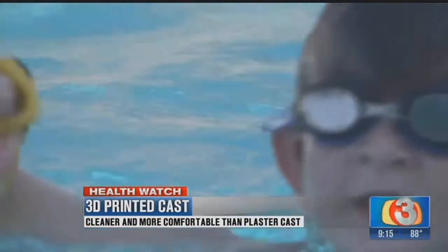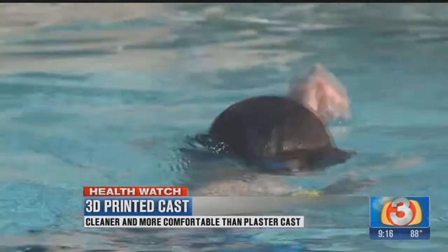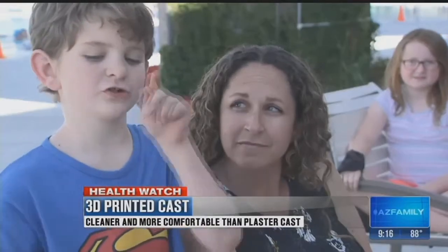Fitzmorris says the fit is actually better than a plaster cast, and he can watch for any wounds, making for better healing and happier patients. It's just better overall care for the patient. It's awesome, it's really cool — you should get one.